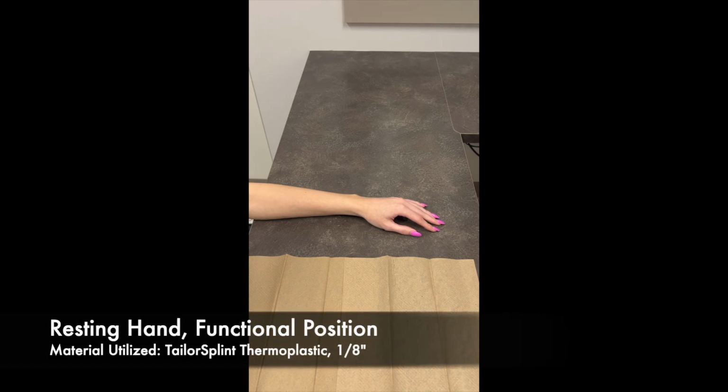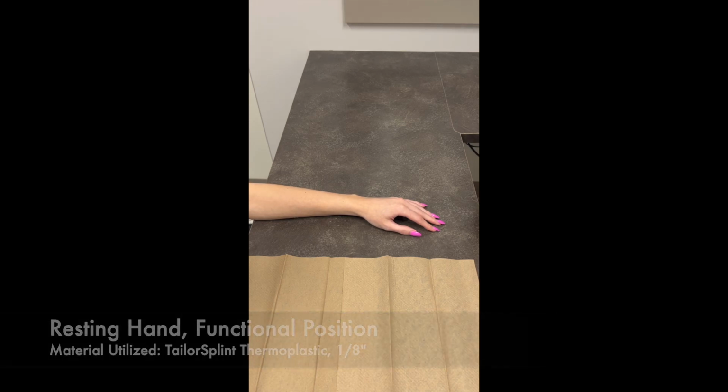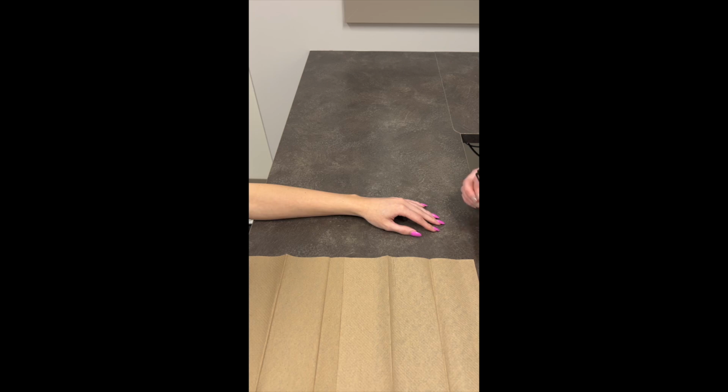We will be making a resting hand orthosis with the fingers positioned in a functional position. So now we will make the pattern.